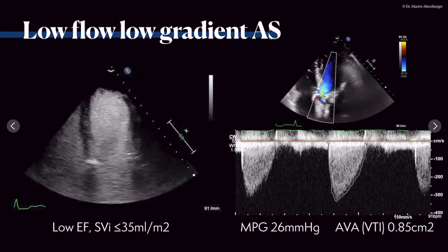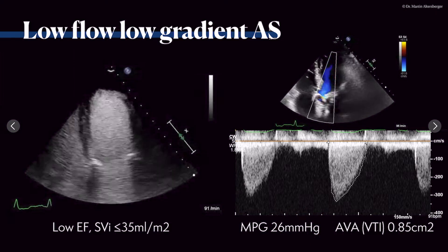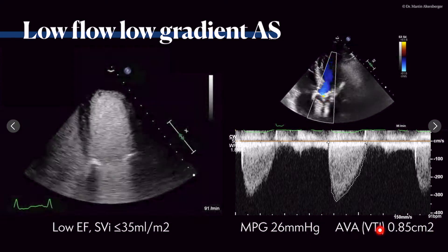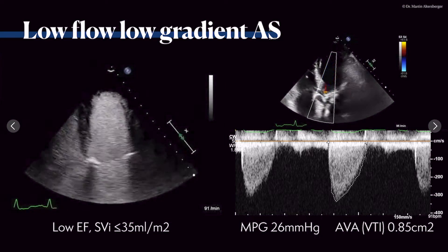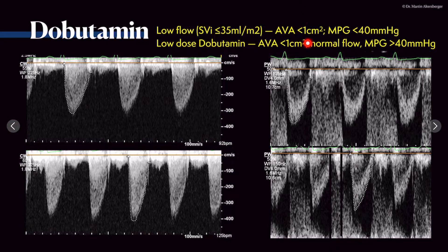The mean pressure gradient of 26 mmHg suggests this is not severe aortic stenosis, but the aortic valve area says it is severe aortic stenosis. What can we do? We can apply low-dose dobutamine stress echo in this low-flow situation where the stroke volume index is below 35 milliliters per square meter, with a low gradient and a very small remaining aortic valve area.